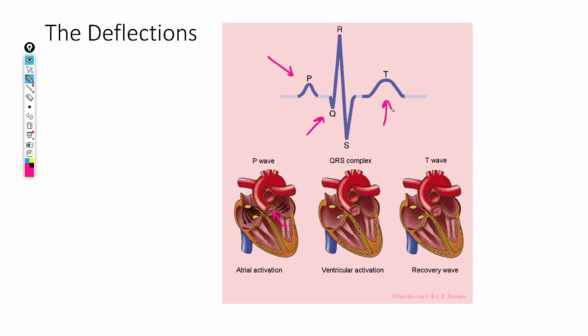And this is the T wave, which is ventricular relaxation and ventricular repolarization. This is when the heart ventricles relax and allow themselves to be refilled passively by the blood coming into the atrium. Now, atrial contraction does not entirely contribute to the blood filling process. Blood filling into the ventricles is mostly passive. Only when there's very little blood in the atria does the remaining blood require pumping. That's what the atrial activation does. Anyway, next slide.